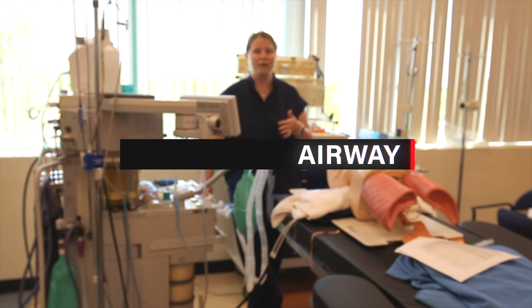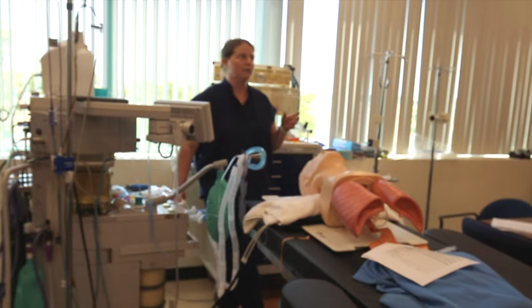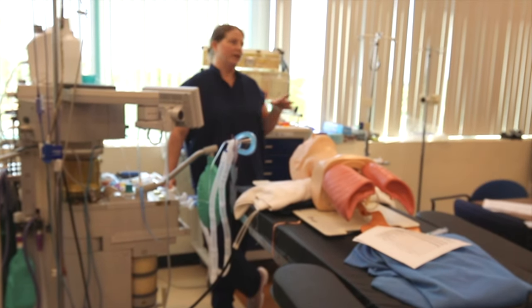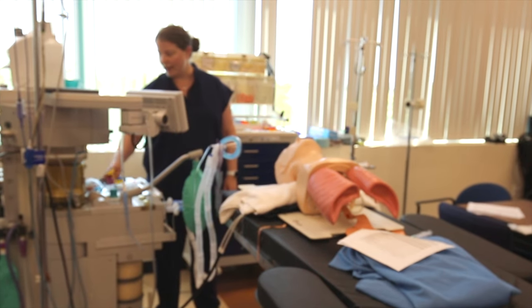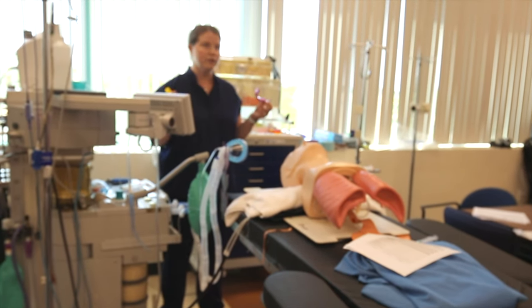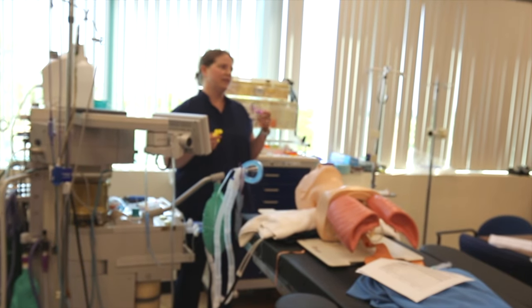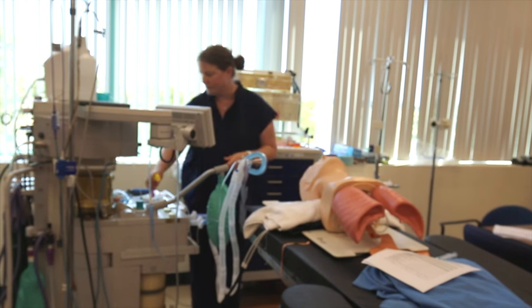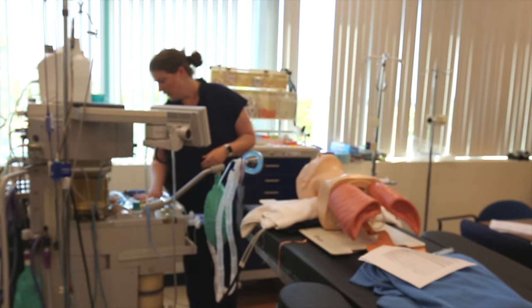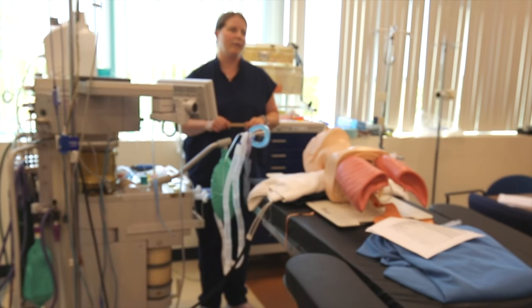That means that you have all aspects of airway management that you think you're going to need for this case and this patient readily available or at least within reach. So always you're going to have OPAs, at least two sizes, one that you think the patient's going to need, and then you can either size up or down depending on your assessment of their airway. Generally for men, I'll grab a 100. Generally for women, I grab a 90.